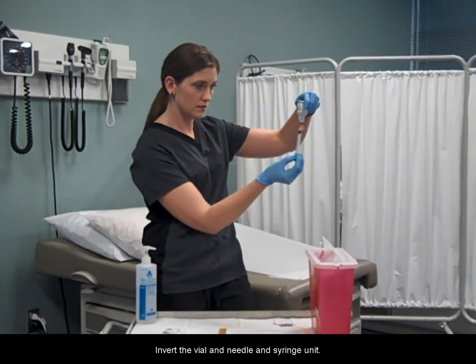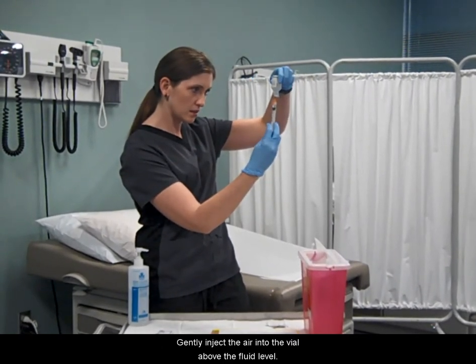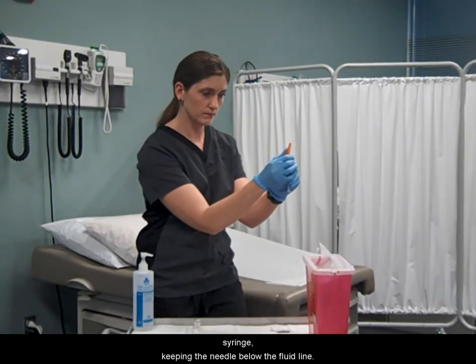Invert the vial and needle and syringe unit. Gently inject the air into the vial above the fluid level. Withdraw the desired amount of medication into the syringe, keeping the needle below the fluid line.